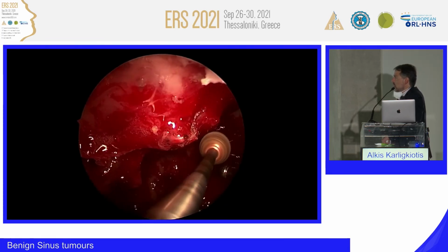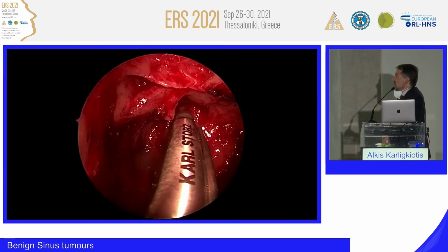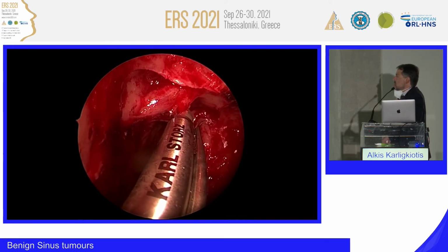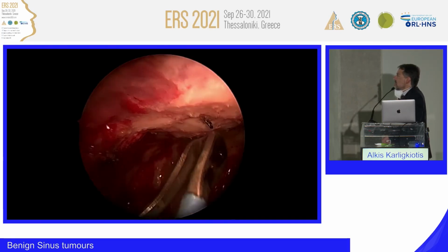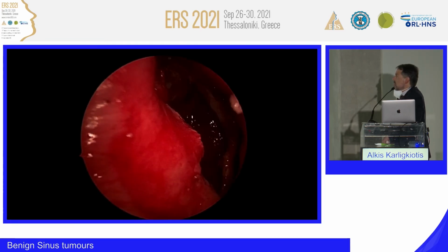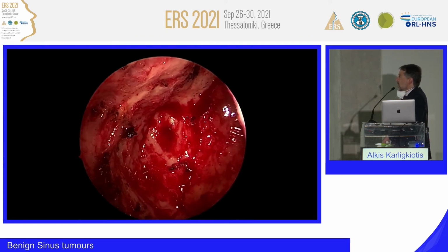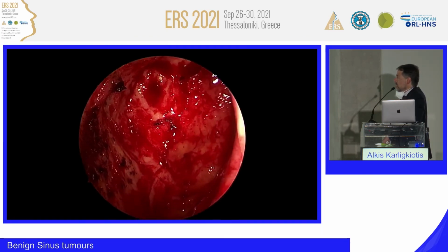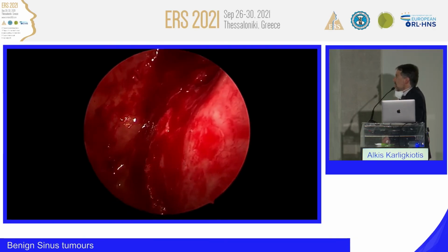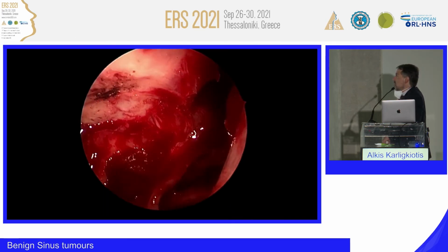It's a very nice approach that permits you to selectively remove the mucosa inside the maxillary sinus and have less morbidity for the patient. This is the infraorbital nerve over there. You get good control in the post-op because you already have a middle antrostomy done, and you can follow inside the mucosa, even with a flexible endoscope if you need. And the patient has less harm.